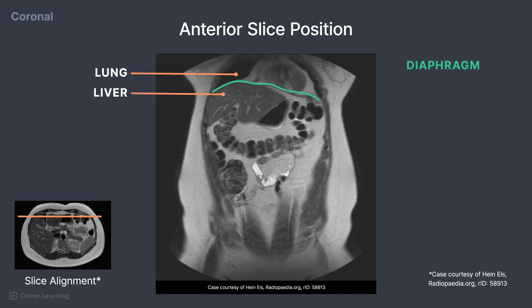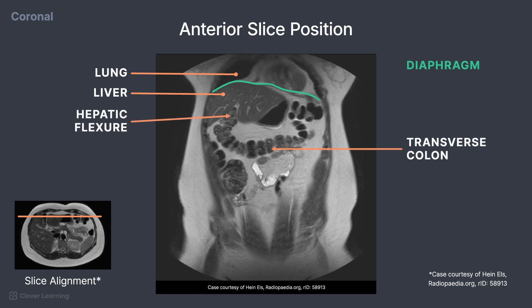Again, portions of the colon that are visible include the transverse colon, the hepatic flexure, and the splenic flexure. We can also see a small portion of the ascending colon just inferior to the liver.